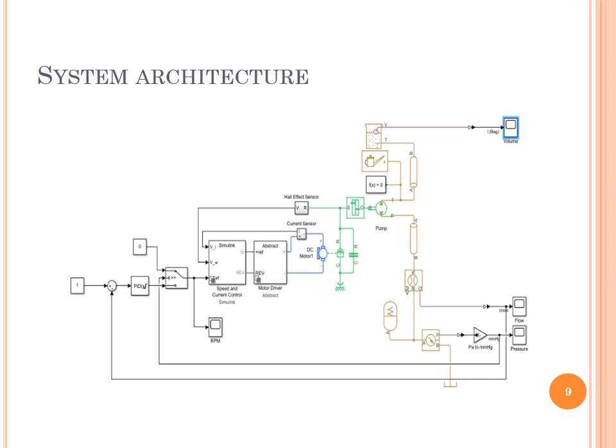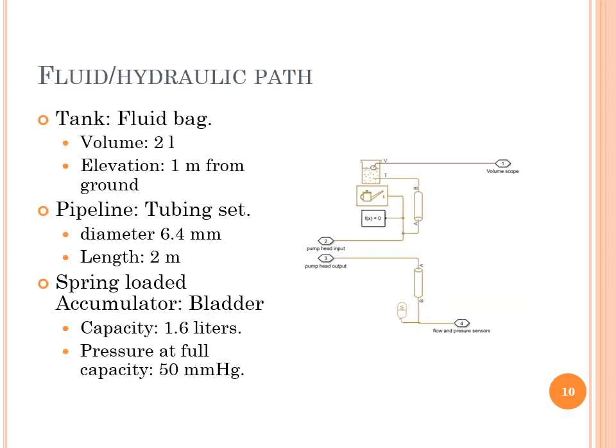The model is composed of two main paths. The electromechanical path is responsible for providing the adequate force to move the fluid inside the fluid path that goes from fluid bags to the operation site. The fluid hydraulic path follows the flow of the fluid from the tank representing the fluid bags to the accumulator representing the operation site. This part of the model is not included inside the actual machine.